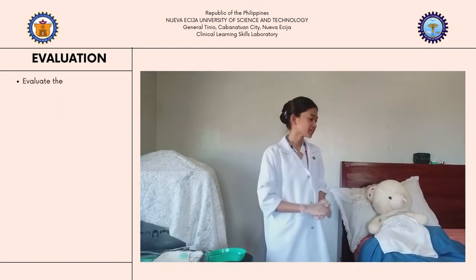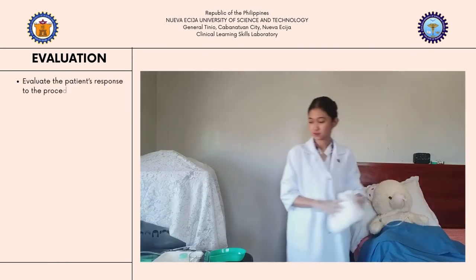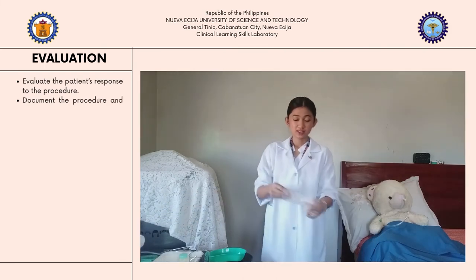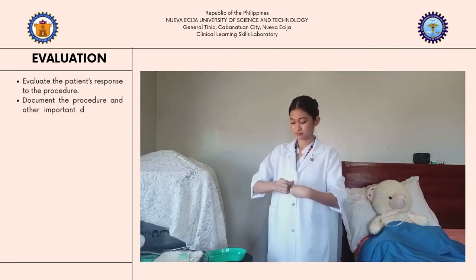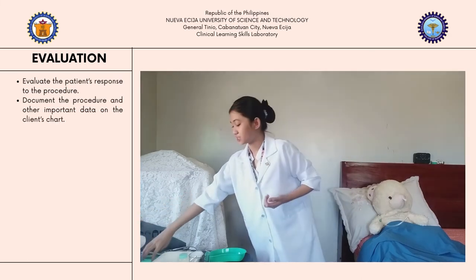After the procedure, discard the disposable pad or towel. Remove your gloves, and perform hand hygiene.